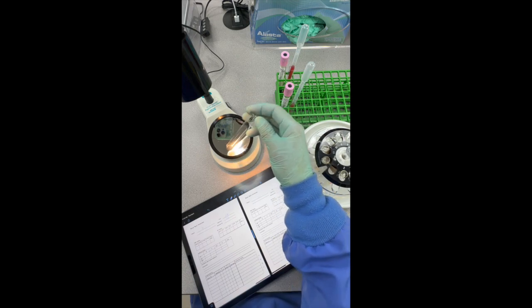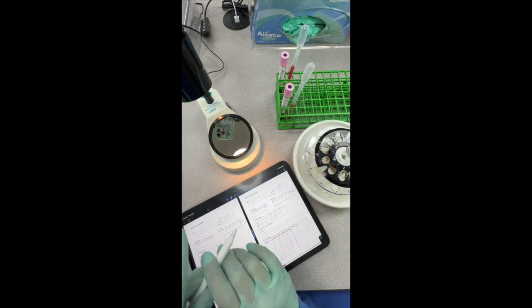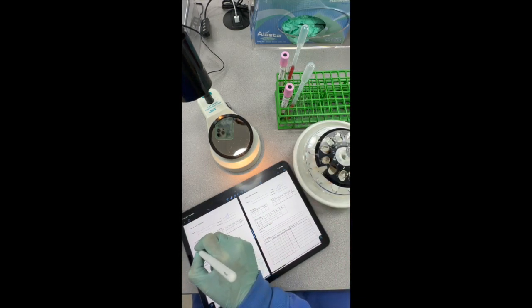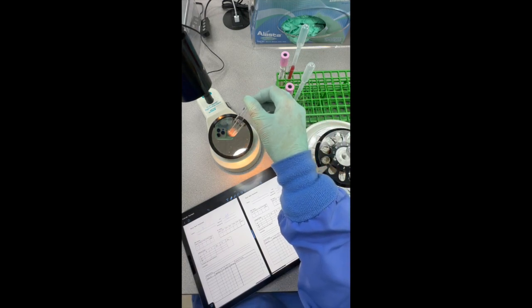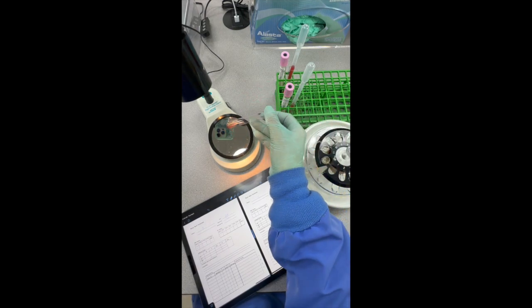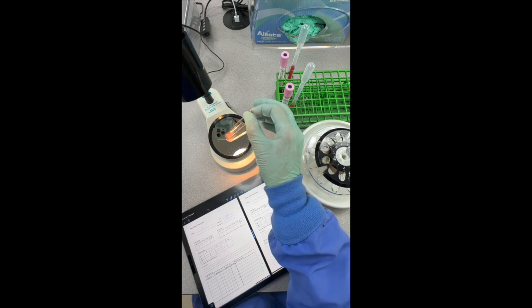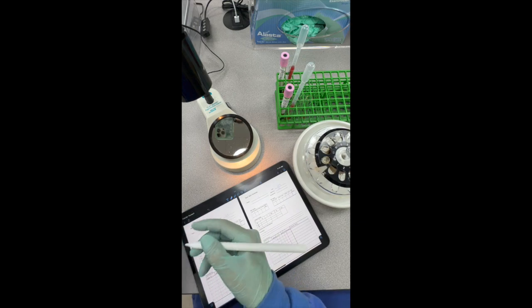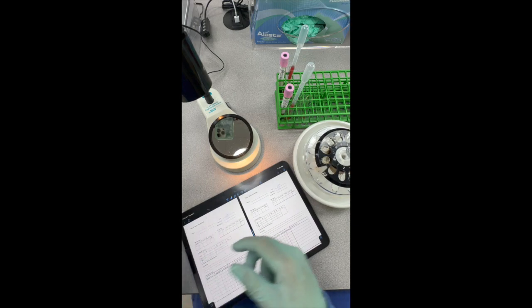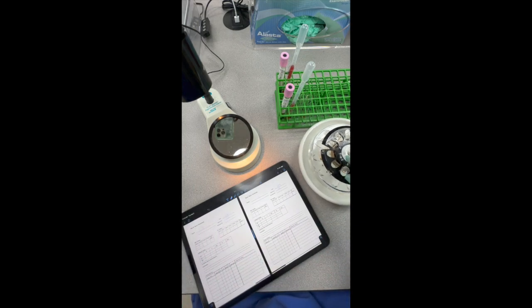And so for our patient H, our A cell's negative, so we'll record that on here. Take a look at our B, and that just streams right off of there. Shake, tilt. Okay, it's negative as well. We'll look at our D.